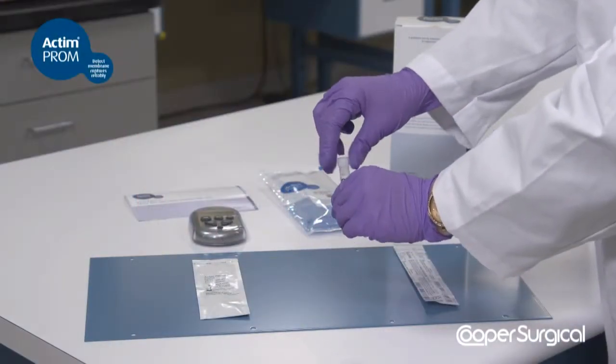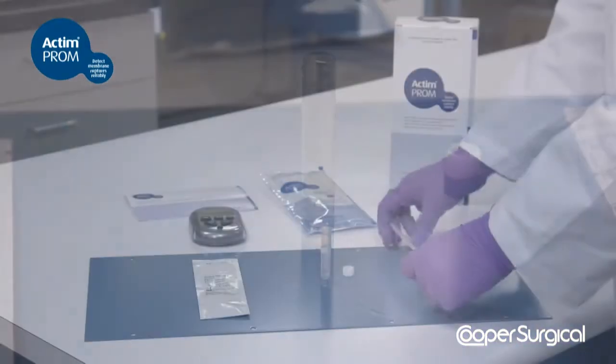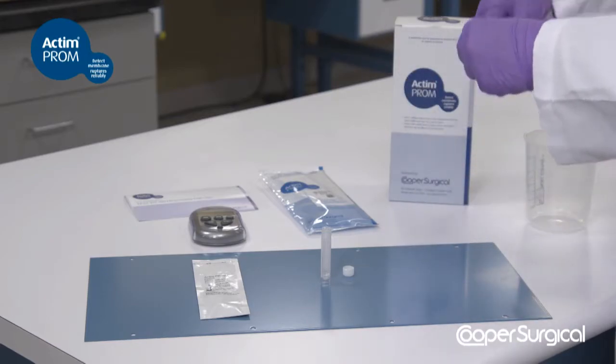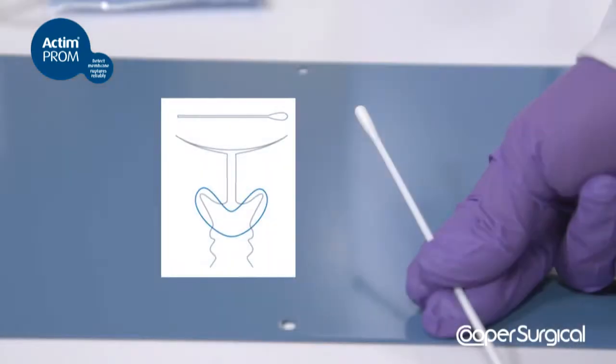Open the specimen extraction solution and place it in a vertical position. Take the sample using the sterile polyester swab, which can be found in the Actimprom kit. Insert the sterile polyester swab into the vagina for 10 to 15 seconds so that it absorbs vaginal secretions.